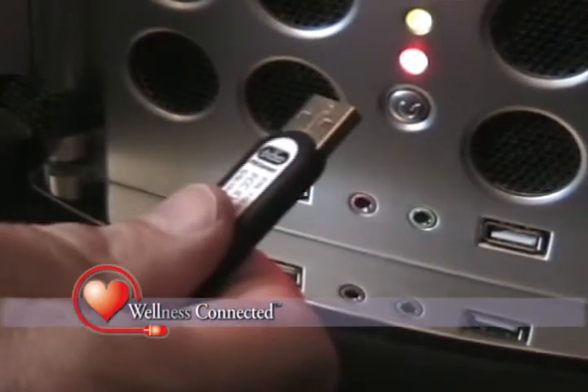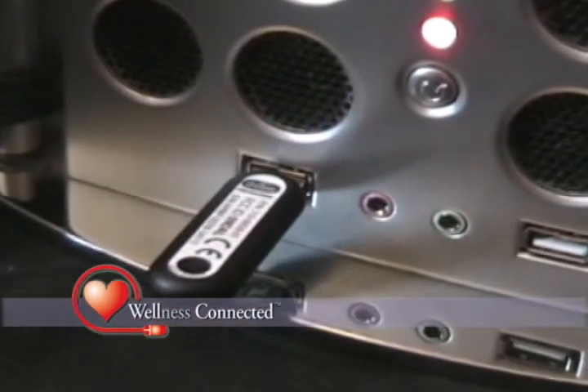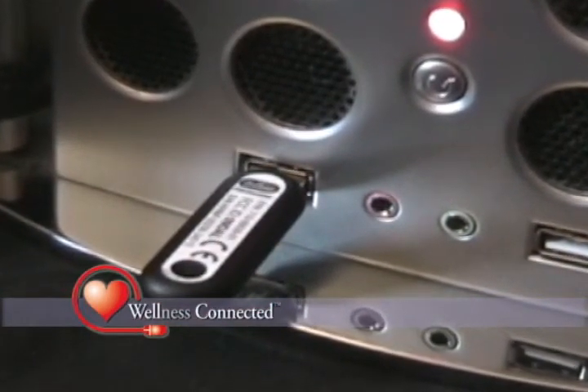Then plug the ActiLink transceiver into any free USB port on your home computer. It acts as an antenna and wirelessly receives your daily blood pressure readings.